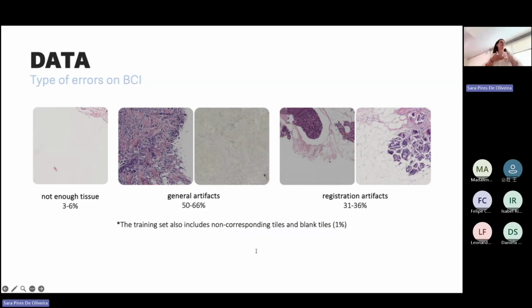Of course, if you assess the metrics here, it will be super good because it's all white, even though the model might not be learning anything. We have general artifacts too: because they had to register the two slides, there's a defect on the tissue, kind of a brush sometimes. So we see a stripe, some repetition, or even worse, complete distortions on the tissue, like on the right.